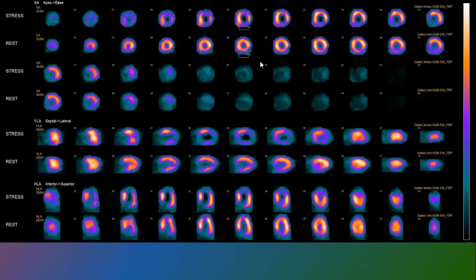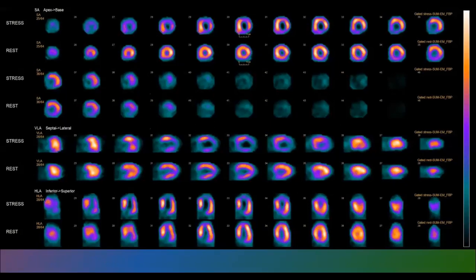So this is a myocardial perfusion scan, how it is going to look. You are going to see bright spots or dull spots, different regions, depending upon the uptake. On the rightmost side, this is the panel here. This is the region of the myocardium which has absorbed most of the isotope. And if this is the color which appears, it means it hasn't absorbed any isotope. And in between, if you appreciate this type of color on the scan, then it means it has absorbed a moderate amount of the isotope.